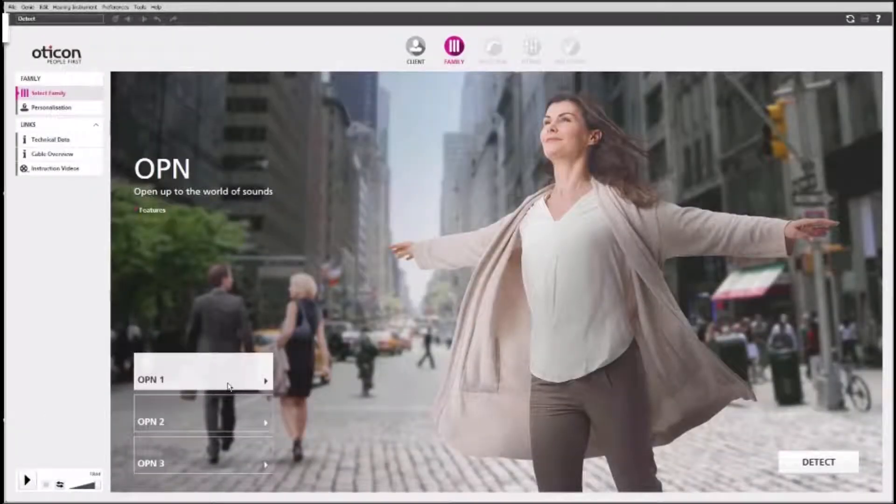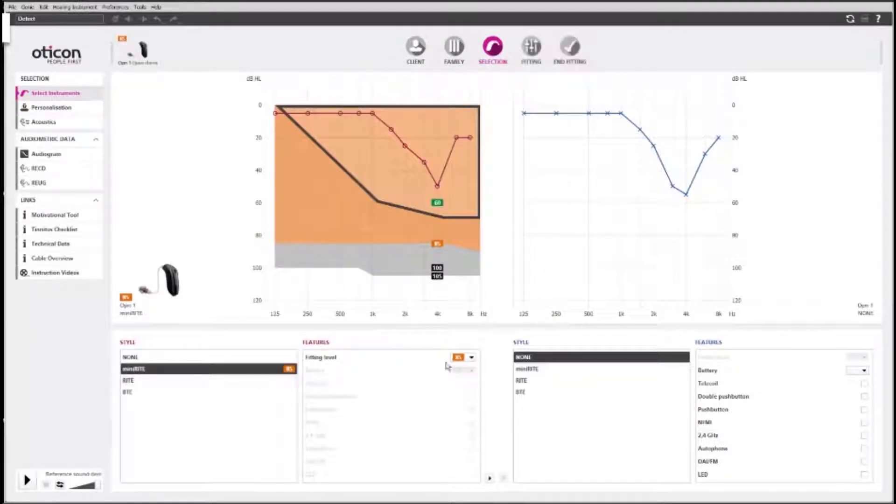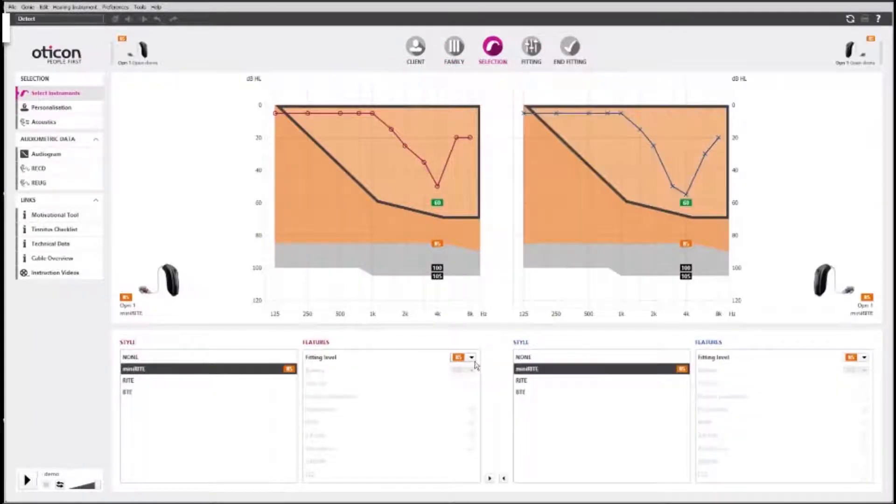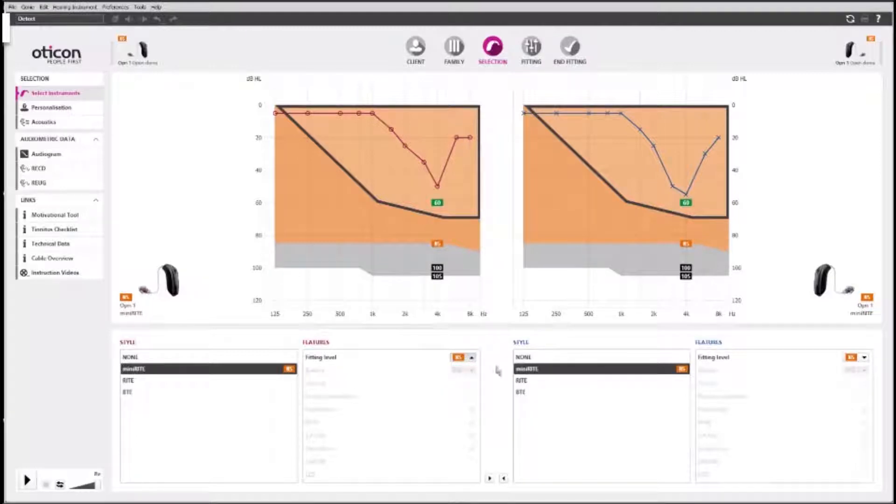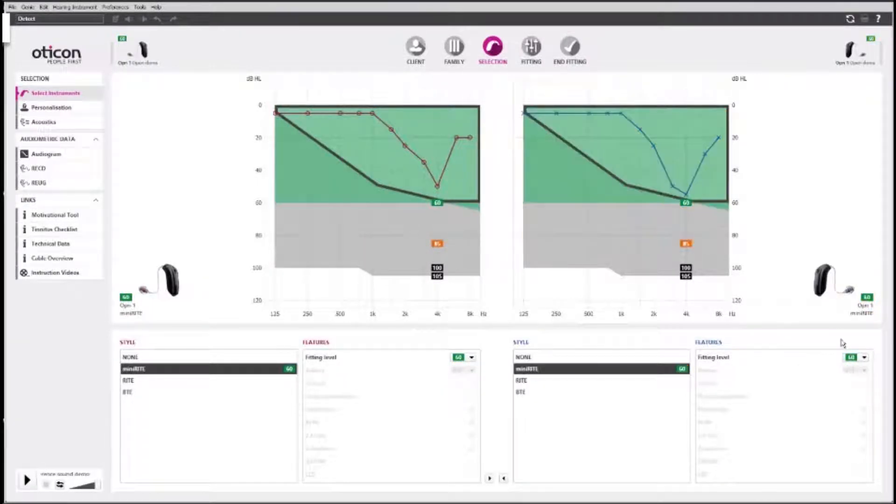First, select the hearing aid that is relevant for your client. Tinnitus Sound Support comes with all styles of open hearing aids.